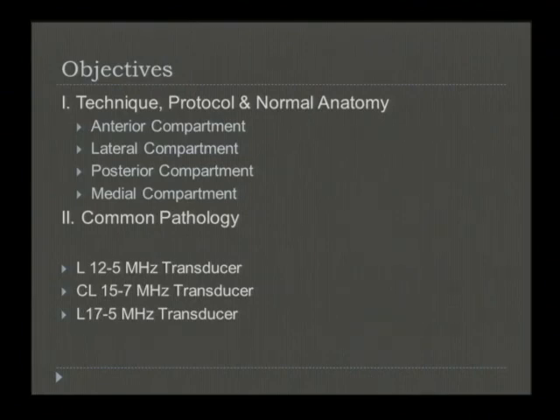Typically, we'll focus on one area and look at all those structures, and we have our technologists look at certain structures in the same way so that when we look at the images, we'll be able to go through them quickly. If you do set this up in your practice, it is nice to have them in the same sequences. We'll talk a little bit about our protocol as well as spend some time with the normal anatomy about the ankle. I won't spend too much time on technique because I know several of the other speakers have talked about how to visualize the tendons and nerves.